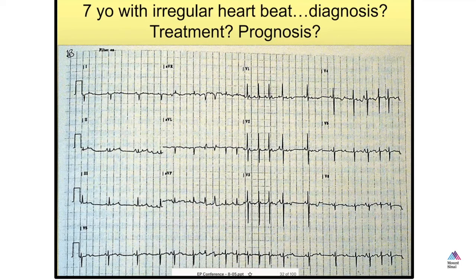So is the rhythm regular, Mahmoud? No, it's not regular. It's an irregular rhythm. Is it regularly irregular or irregularly irregular? It is irregularly irregular. That's right.